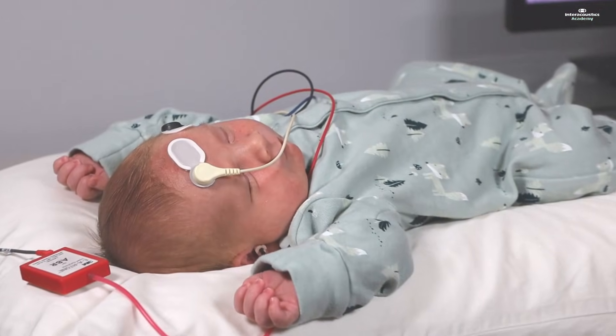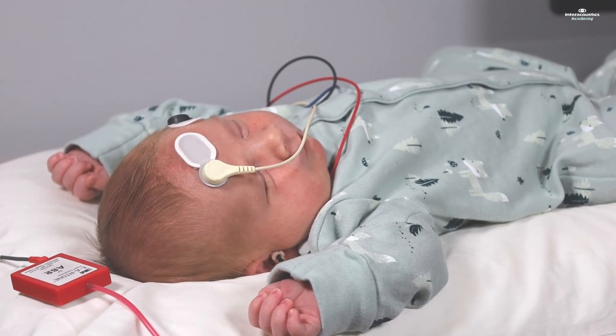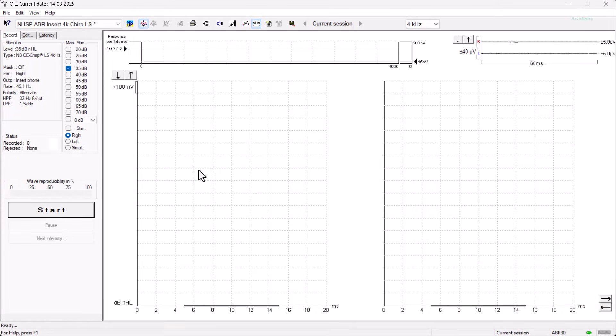Now we are ready to start testing. Insert earphones are in and we're going to be testing the right ear first using a four kilohertz narrowband CE chirp. We're going to start testing at 10 dB above discharge level, which is 35 dB NHL for this patient.